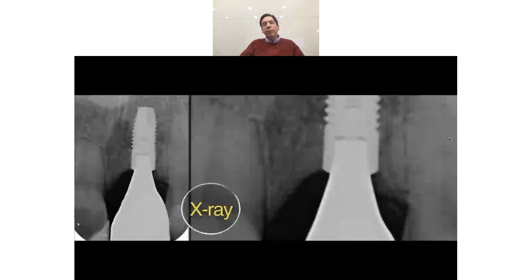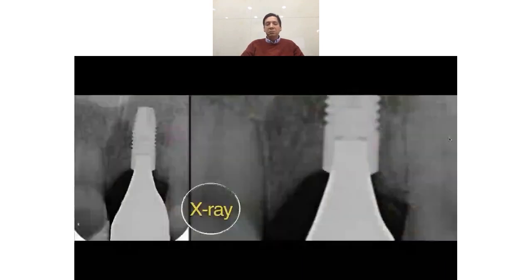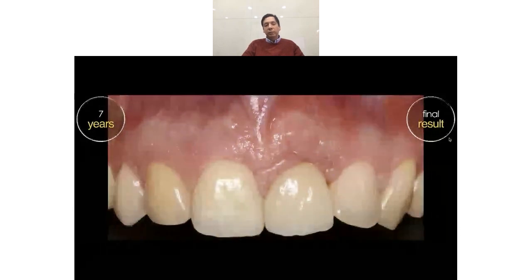But what is the best for me is seeing the maintenance of the bone. The maintenance of the bone is totally, totally healthy, strong, radiopaque. And one question is this new attachment, new periodontal attachment, is it an ankylosis? I really don't care. I see a nice result. The lateral incisor is fine. There's no resorption on the root. So for me, the result is fine. For the patient, more than perfect for him. I would like to place a new CTG, but he doesn't allow me to do it. So this is the long-term 7 years result.